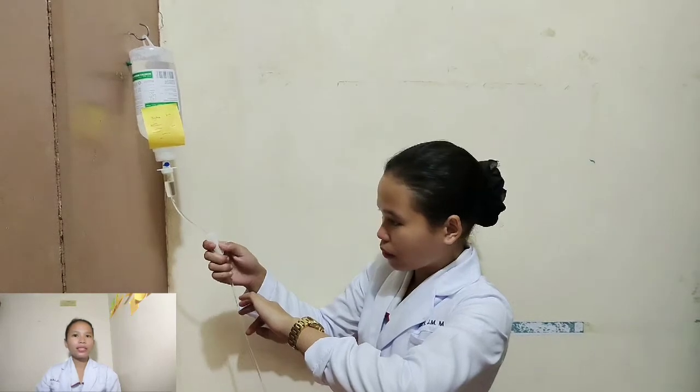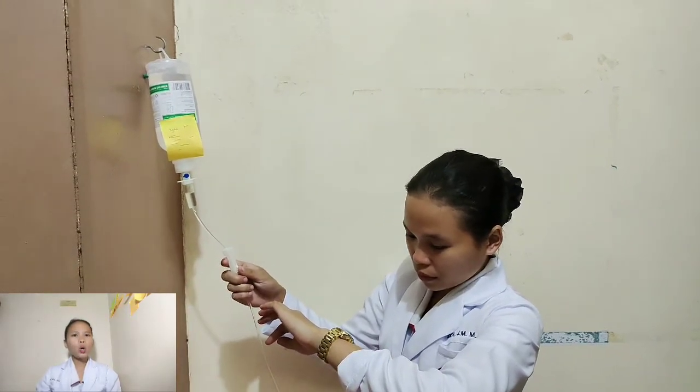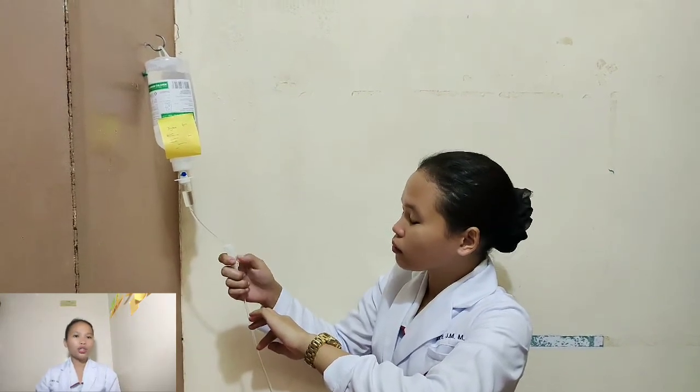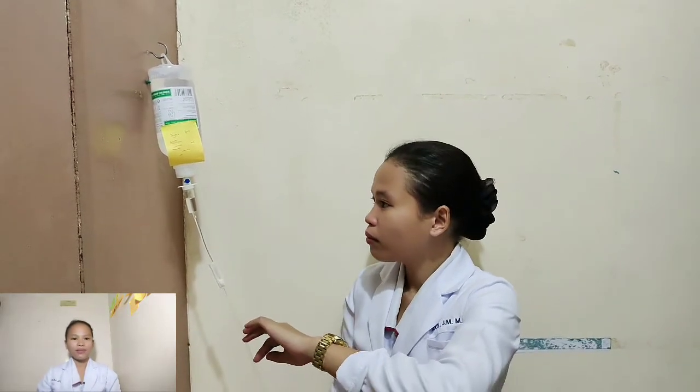Use paper and pencil or a calculator to calculate the flow rate. Use mathematical calculation to obtain the correct rate. Count the drops per minute in the drip chamber. Hold the watch beside the chamber. Holding the watch next to the drip chamber allows the eyes to focus on the drops and the second hand on the watch to provide an accurate count.